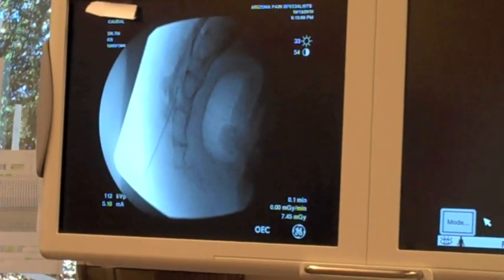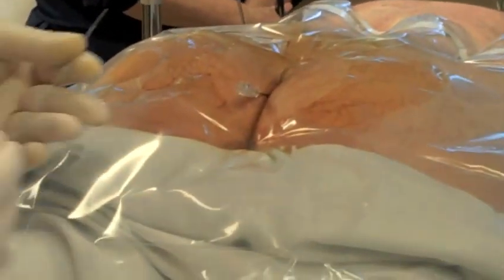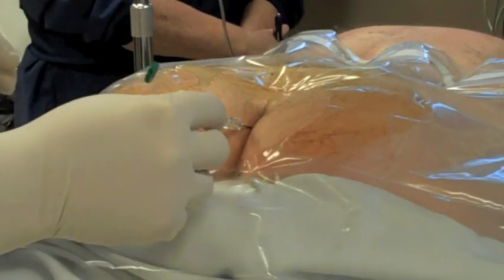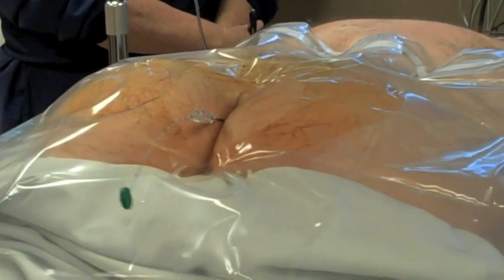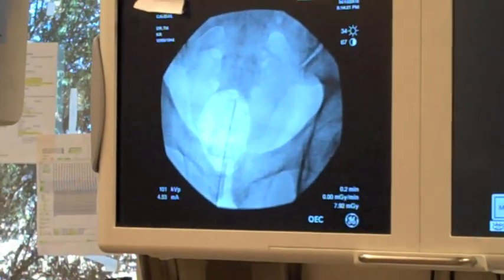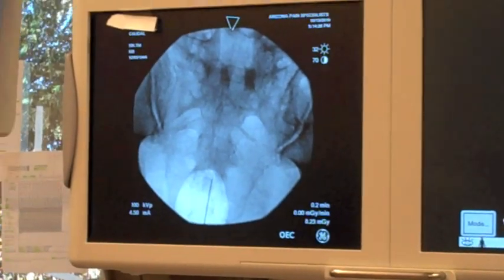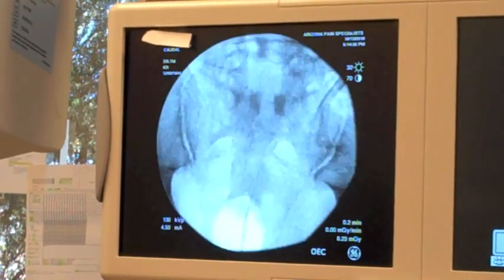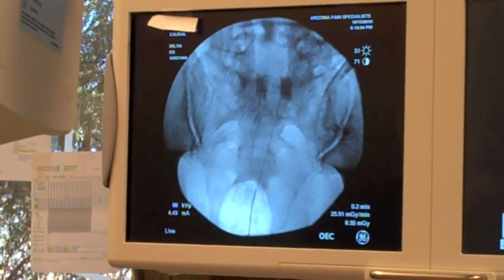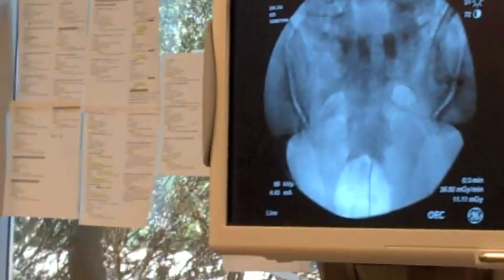We'll go to an AP view now. That catheter slides right through the needle and we'll steer that catheter up. You can see the needle coming into the sacral area. We're going to keep directing this catheter right up into that area towards the right side, where his worst pain is.